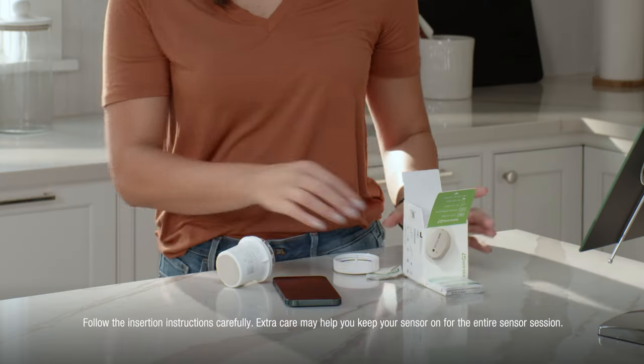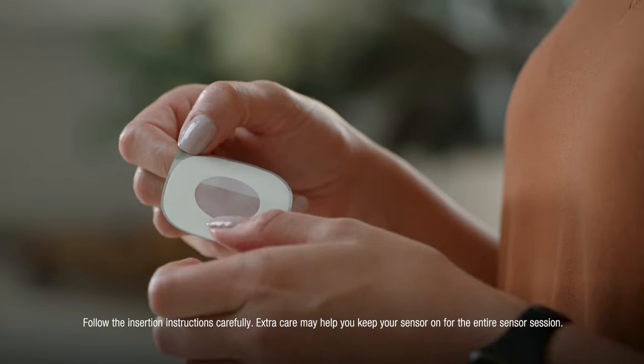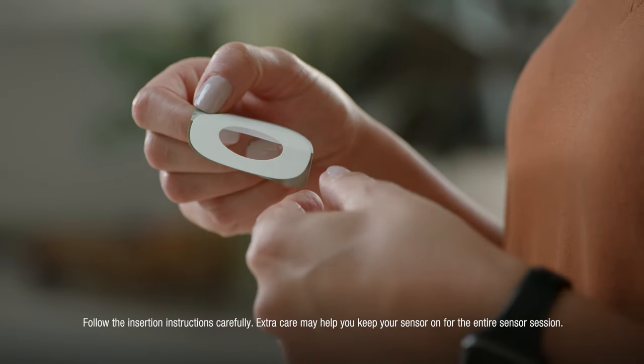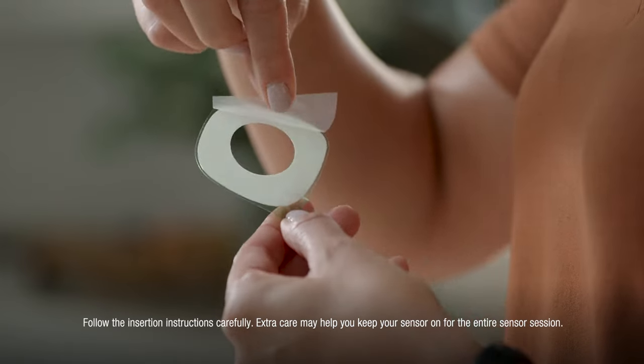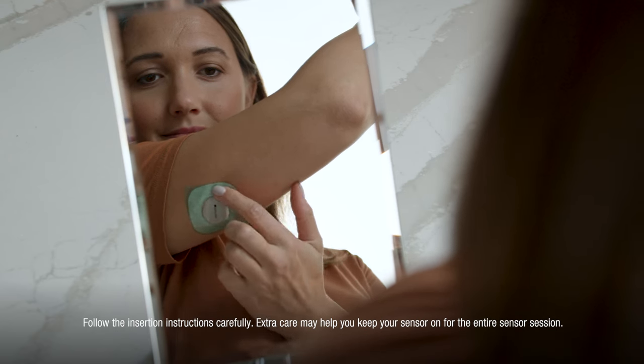Your overpatch will help you keep the sensor on and is bundled with your instructions in the box. Carefully pull off the clear liners one at a time. Please don't touch the white adhesive area. Use the colored tab to place the overpatch around the sensor. You may need to look in a mirror for this part.